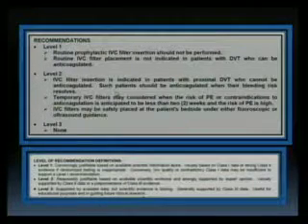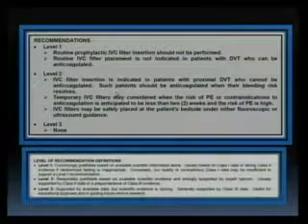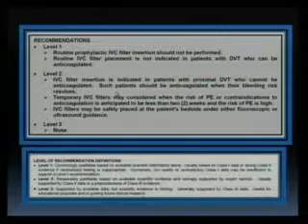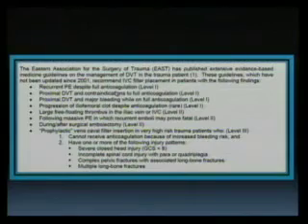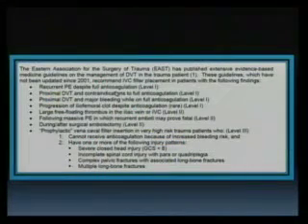anticoagulation. Temporary filters may be considered when the risk of PE or contraindications to anticoagulation is anticipated to be less than 2 weeks. And there are no level 3 recommendations. Then similarly, when you look at the extended indications of the Eastern Association for the Surgery of Trauma, this was published initially in 2001. It has not been revised recently.